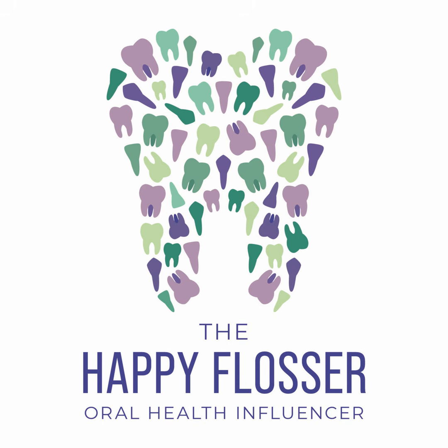The radiographic density, the shape, the size, the extent of the internal architecture, the borders, all of these things give us clues. So the borders especially tell us a lot about the biology. So when I tell you that the surrounding bone is intact and encapsulated in those lesions, those are typically okay.